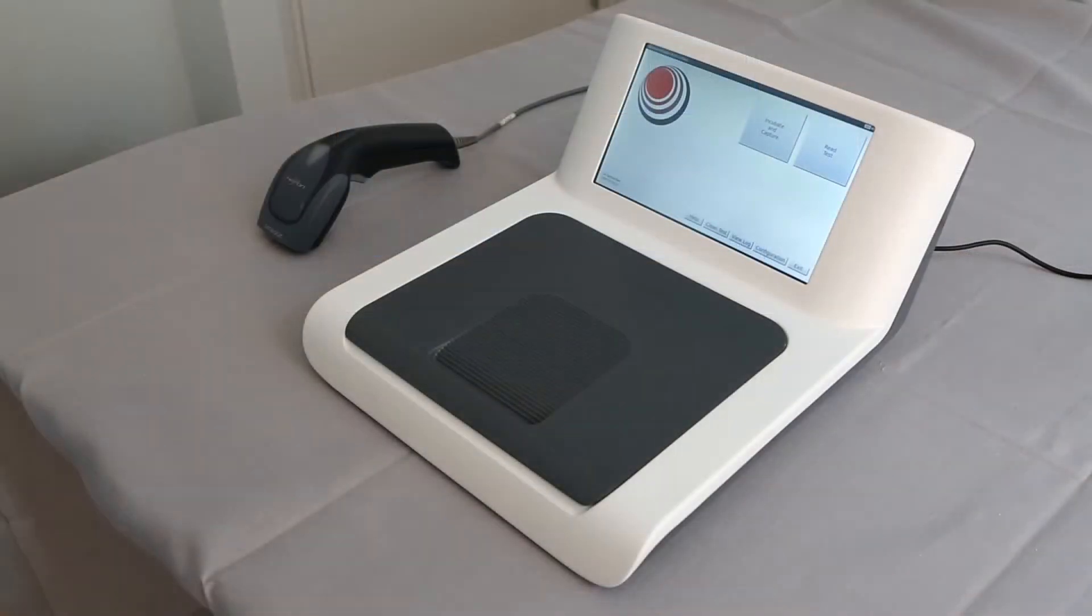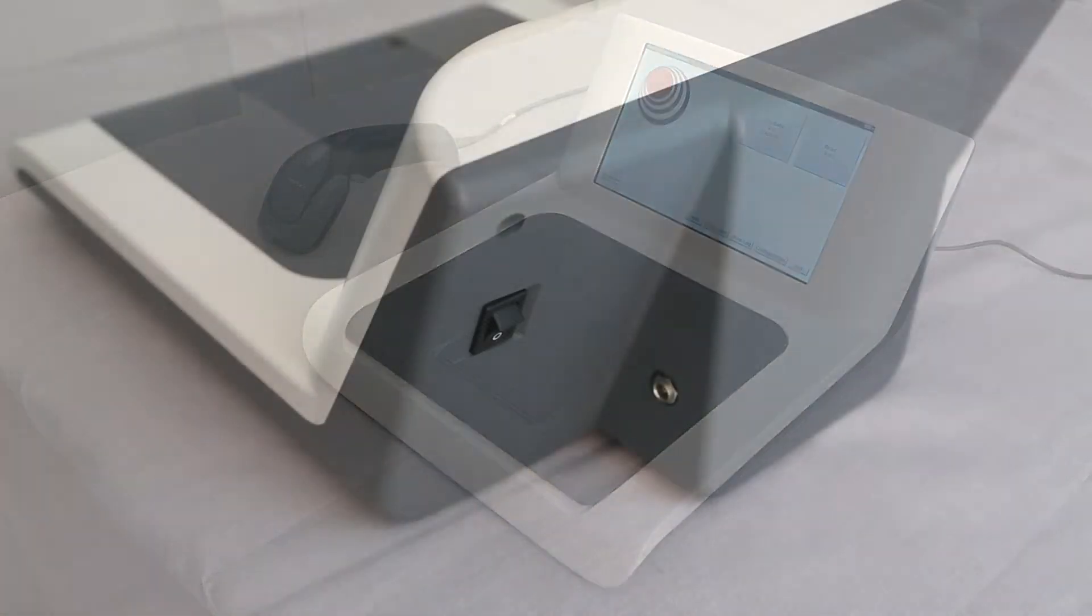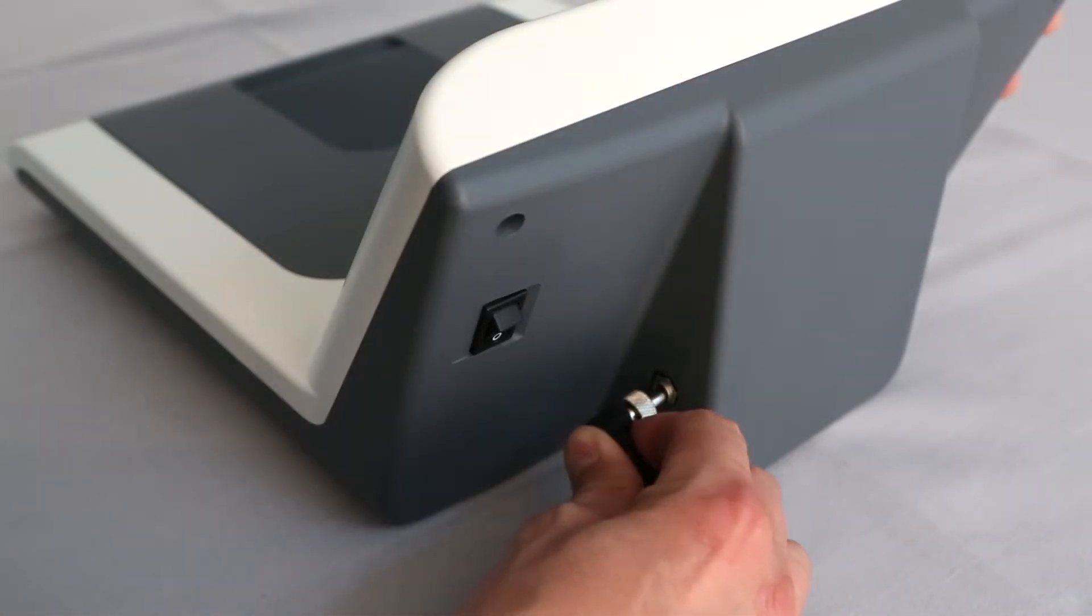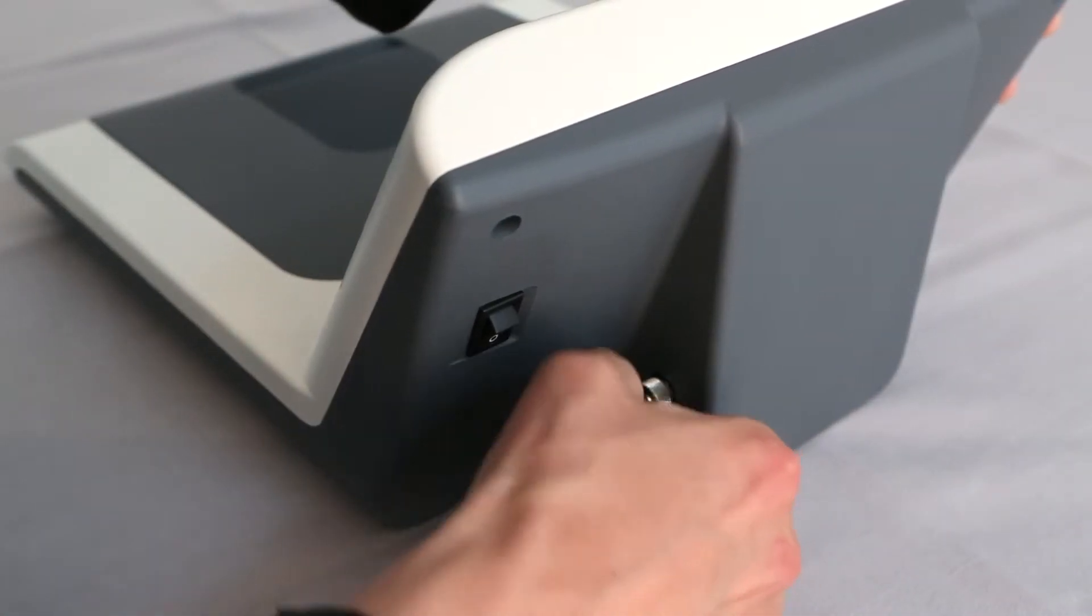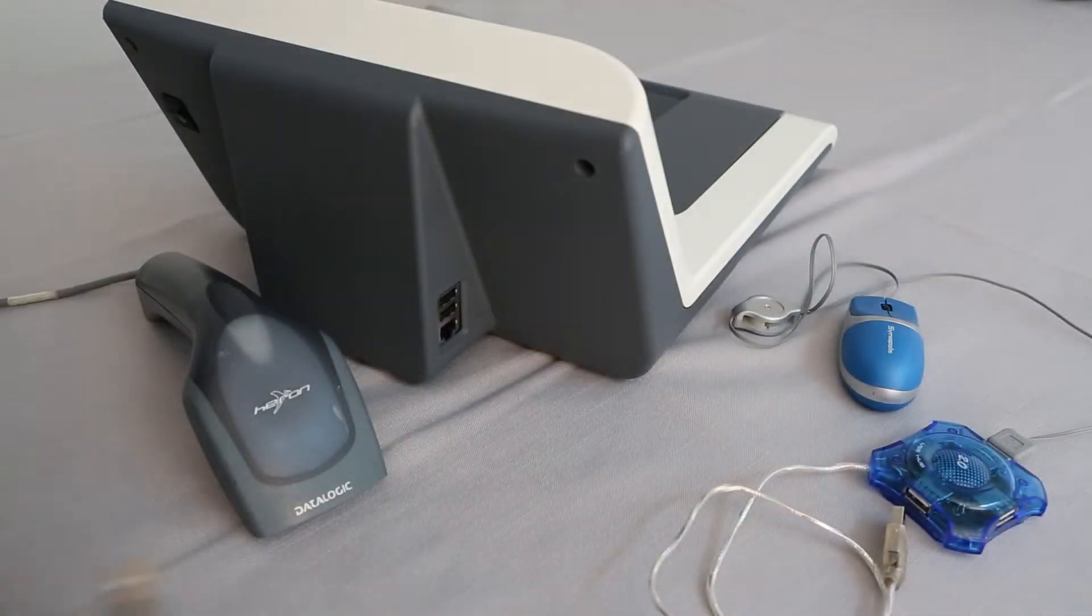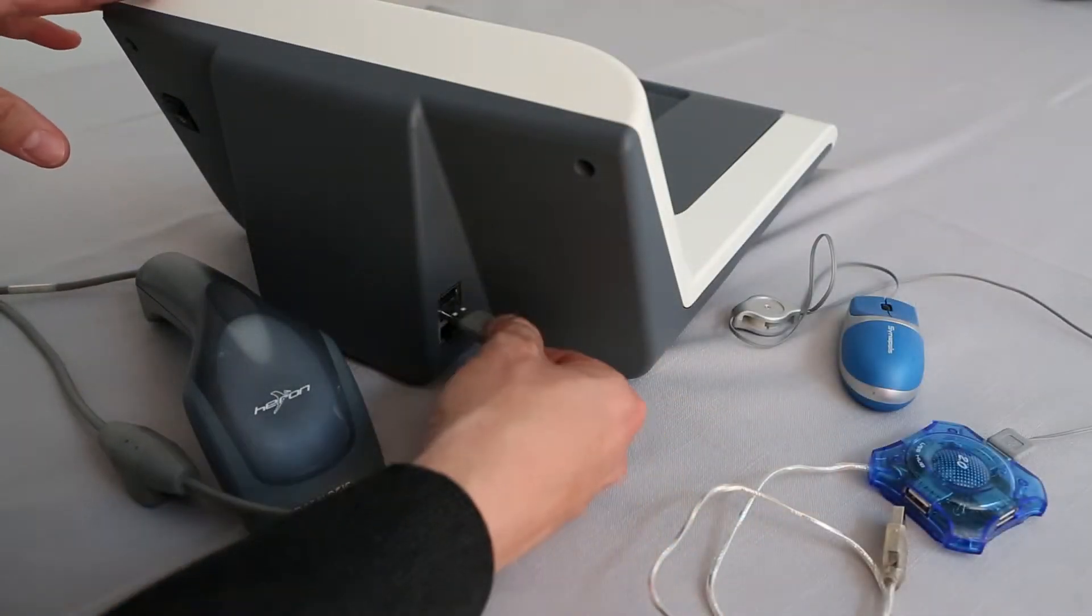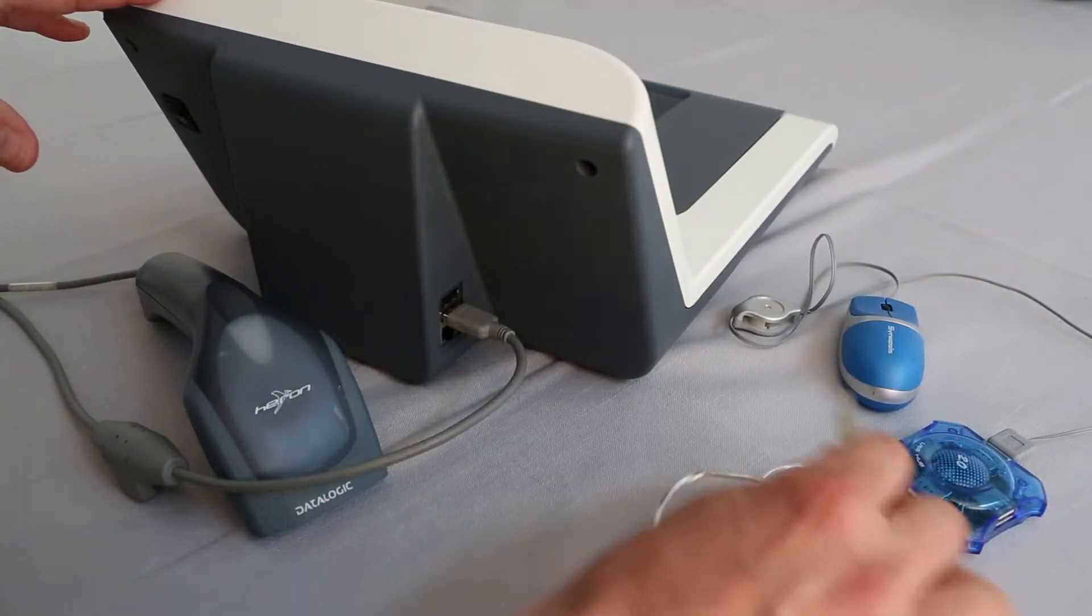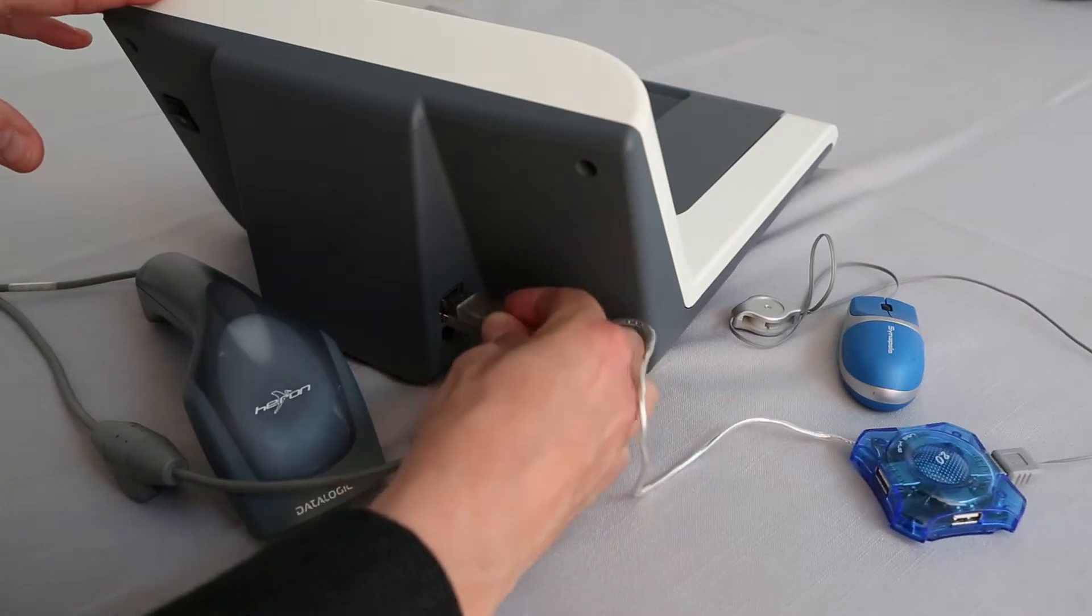The ScanFlexi reader is an elegant stand-alone desktop instrument. Connect for power supply and internet connectivity at the back of the instrument. Here you also will find two USB ports for memory sticks or mouse.